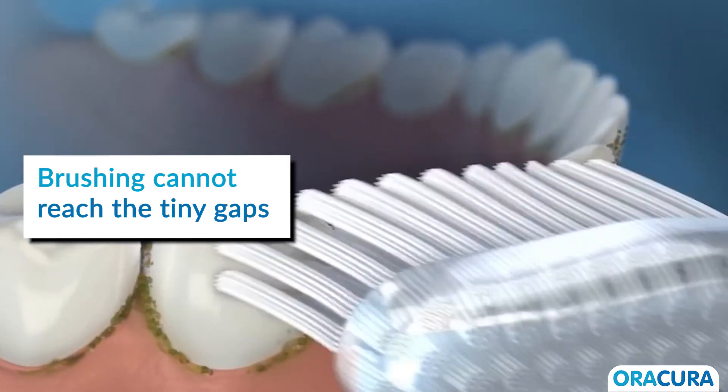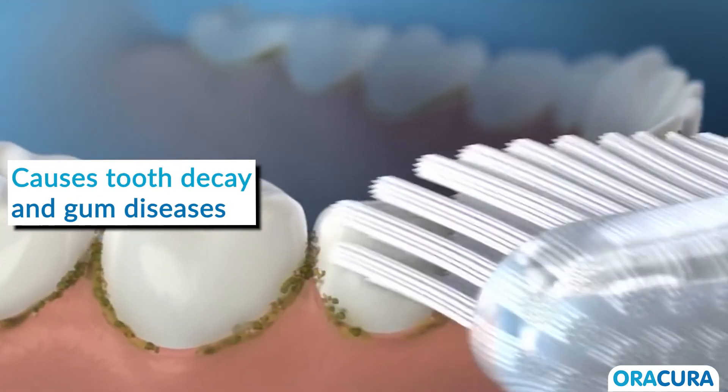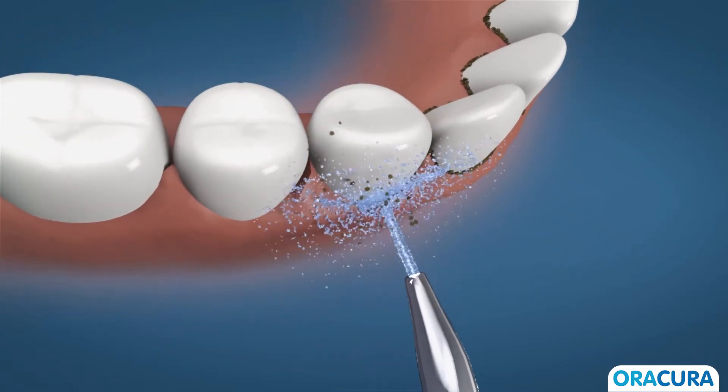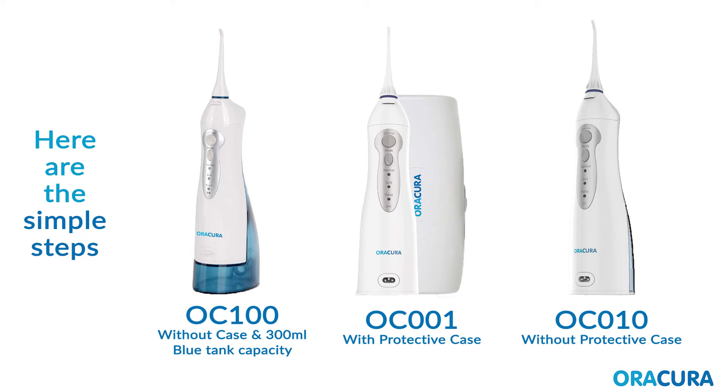Brushing alone cannot reach the tiny gaps between the teeth, which causes tooth decay and gum diseases. The Arakira Smart Water Flosser is the perfect solution for advanced teeth protection. Here are the simple steps to get you started.